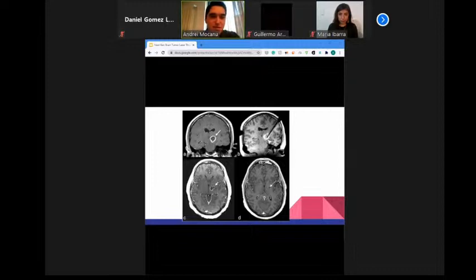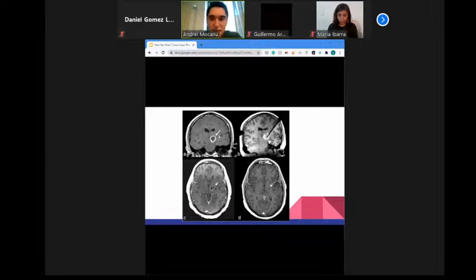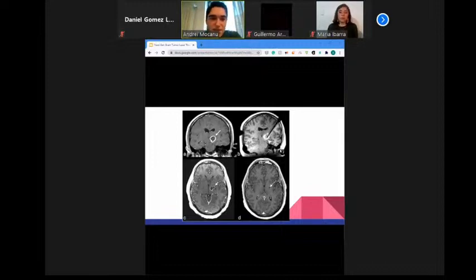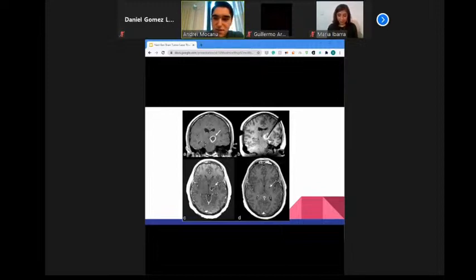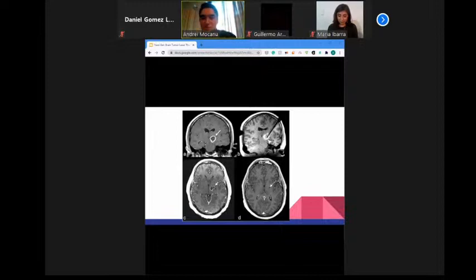Here are T1-weighted MRI scans of a LITT procedure for a glioblastoma. Image A shows a scan before LITT with a ring-enhancing mass visible near the center of the brain. Image B shows the laser probe within the mass, indicated by an arrowhead, taken intraoperatively. Image C, taken two and a half months after LITT, shows a mild decrease in the size of the mass, while image D, taken four months after LITT, demonstrates complete resolution of the glioblastoma.